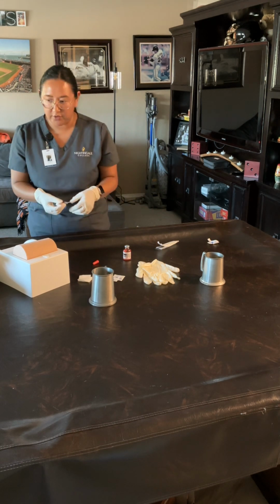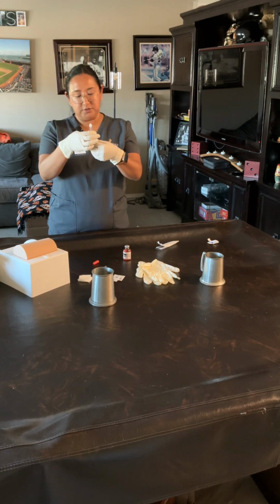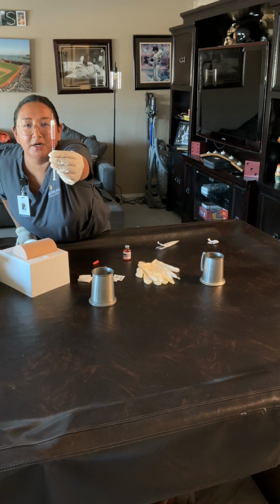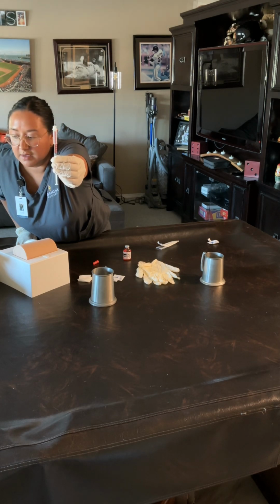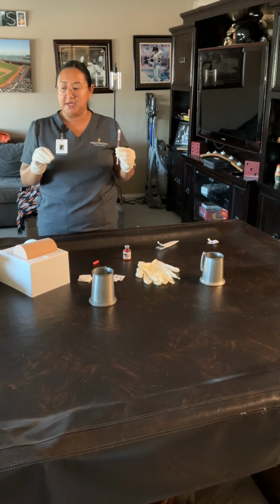Pull the cap over. I'll show the camera my dose. Try my best. It's about 1 milliliter there. I'll hold it there for a second so you can see. I tapped out any bubbles. I verified the correct site.